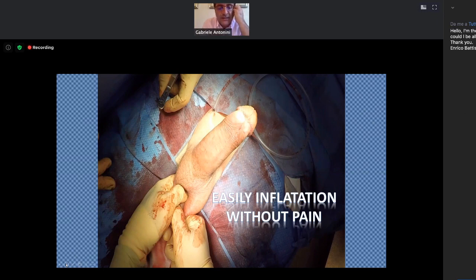This is the most important thing, because you know very well that the pseudocapsula gives to the patient a retraction of the length. If the patient starts quickly the activation and deactivation of the prosthesis, he can gain the length after 15 or 20 days, and without the incision on the scrotum, the patient hasn't pain, and can have, in our experience, the first sexual intercourse after 20 days.